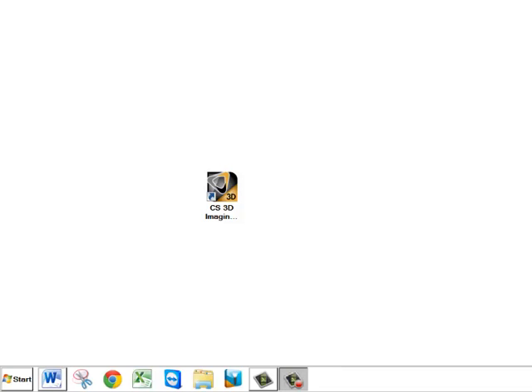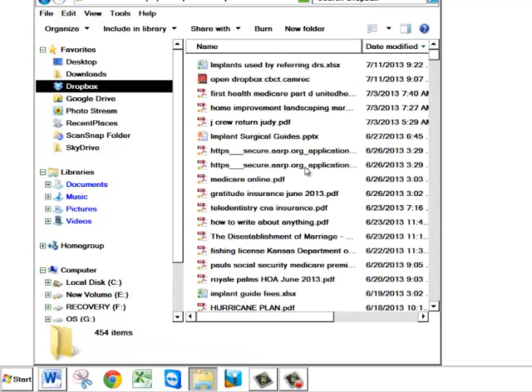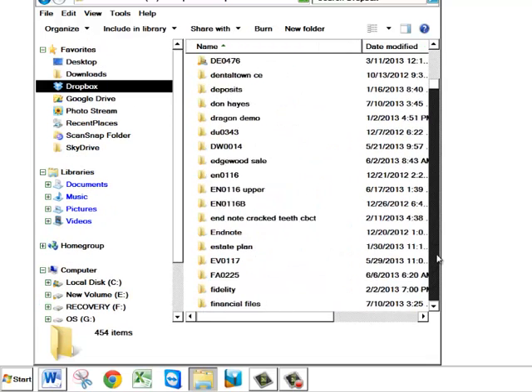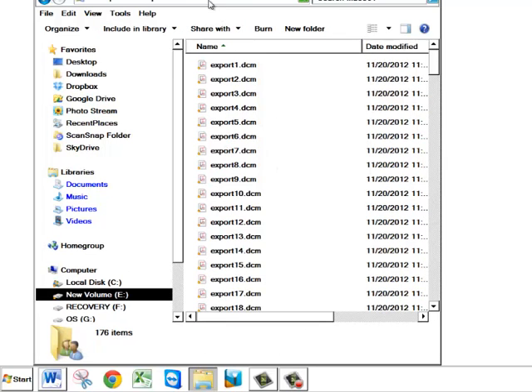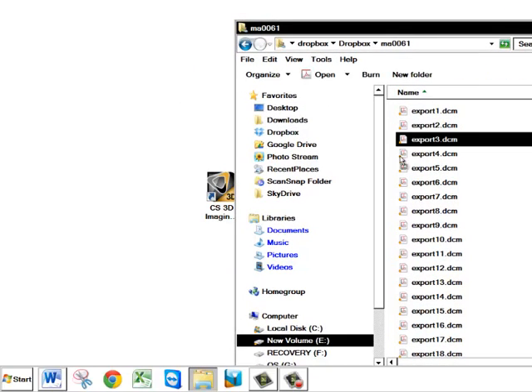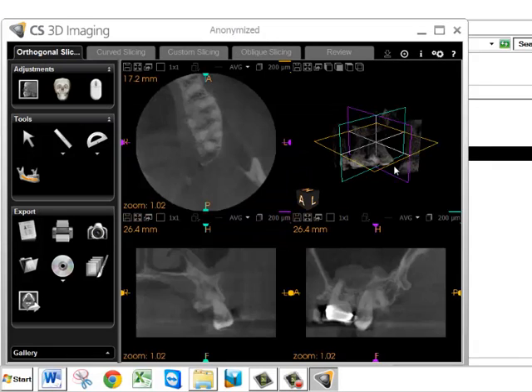In this video, I will show you how to open and manipulate a CareStream ConeBeam CT volume. If the volume was sent by Dropbox, simply click on the Dropbox folder that contains the volume you want to open. Then open the folder and drag any one of the DICOM files to the Kodak CareStream 3D icon on your desktop. This opens the entire volume in the viewer.